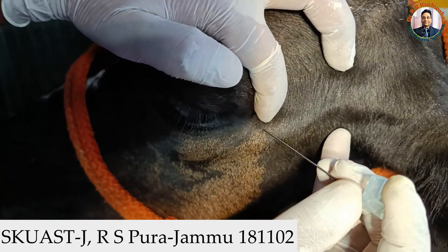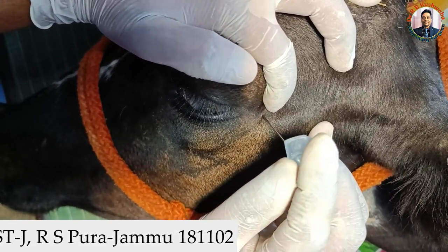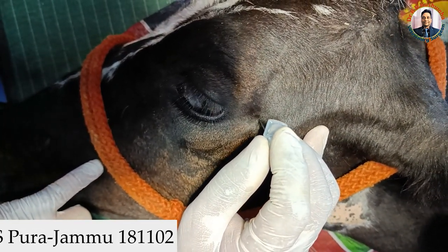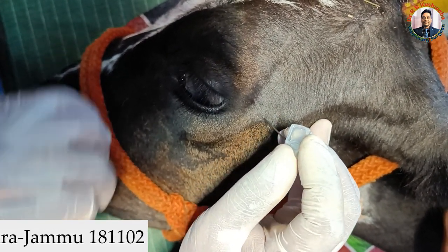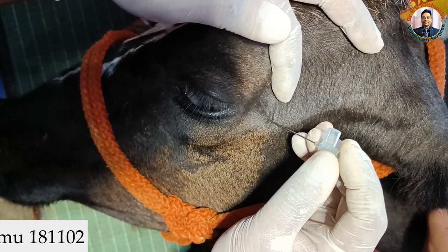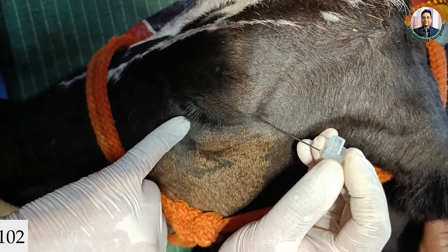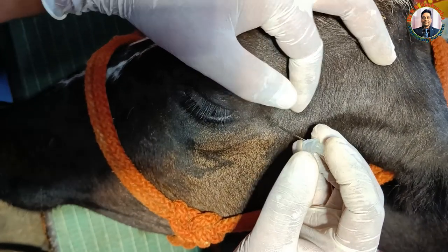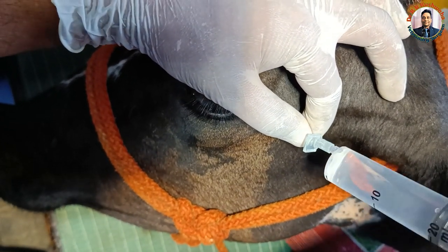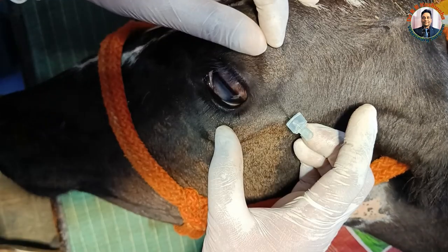First insert straight — if it strikes bone, that's okay. Otherwise, make an angle so that the tip of the needle reaches behind the eyeball. You can inject in between so that there won't be any pain. You can see we have now reached the correct position.